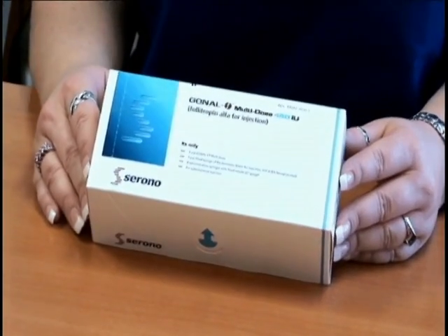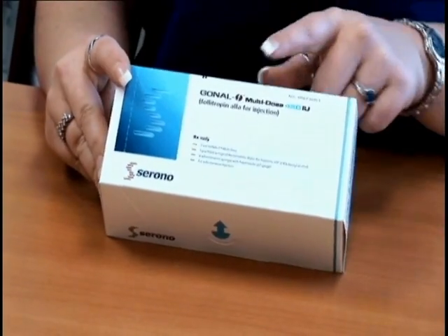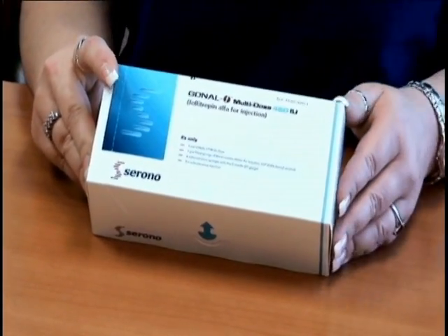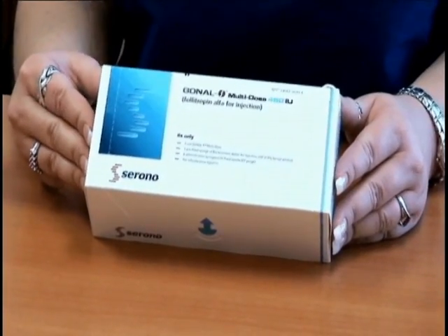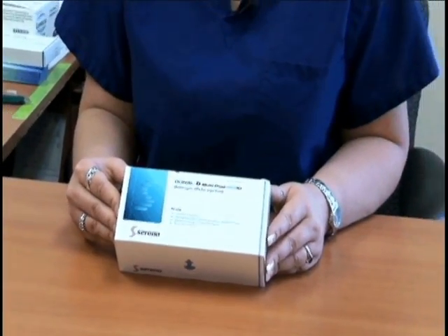The next medication that may be on your calendar is called Gonalef. What I have in front of me is the multi-dose kit at 450 IUs. We recommend using this kit versus the pen because they actually overfill the medication, so you can utilize the extra medication that has been included with the vial.